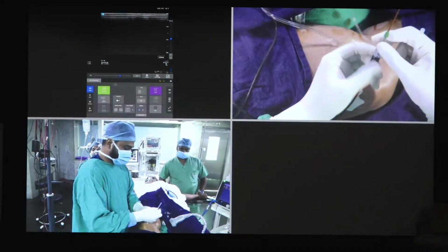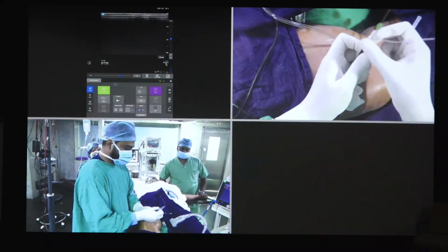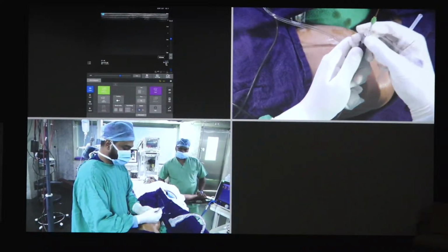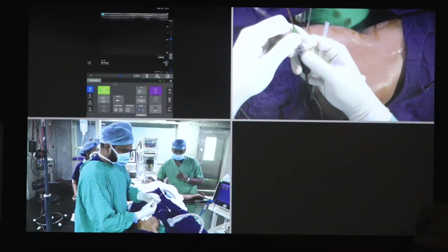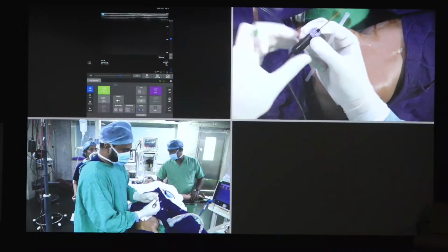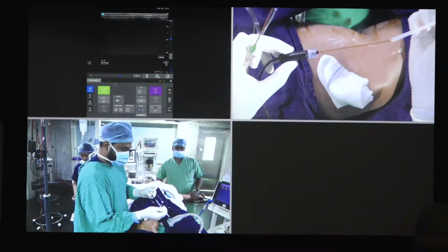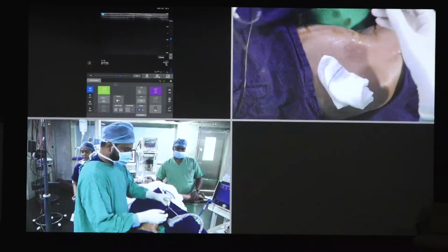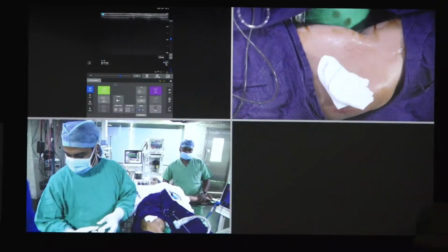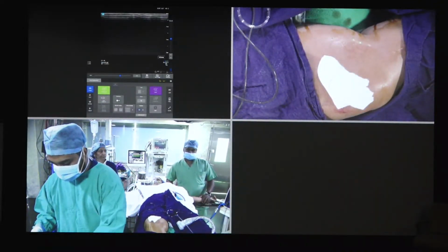After you finish your procedure, make sure you scan the area to see if there is any collection, hematoma or anything, because the needles used in cooled RF are a little larger, so it can injure the genicular arteries. Rarely it can cause hematoma.